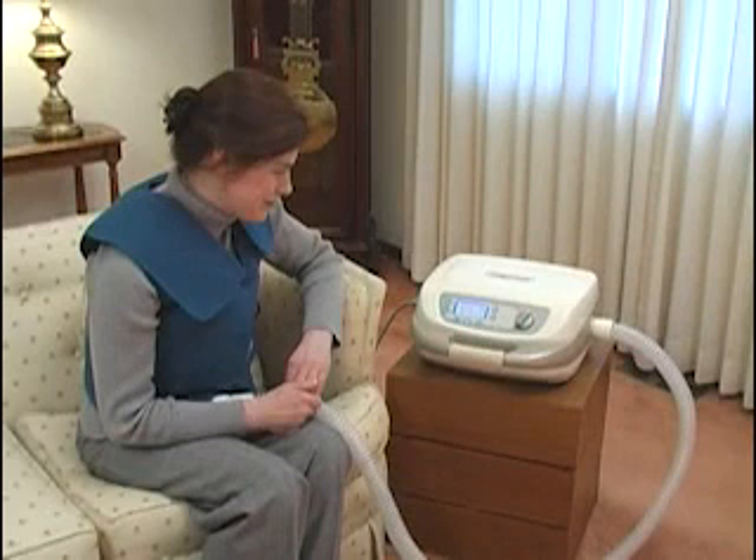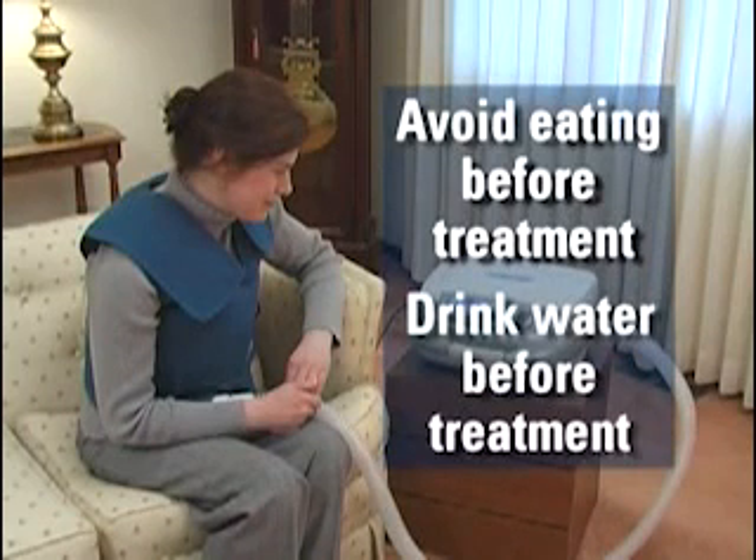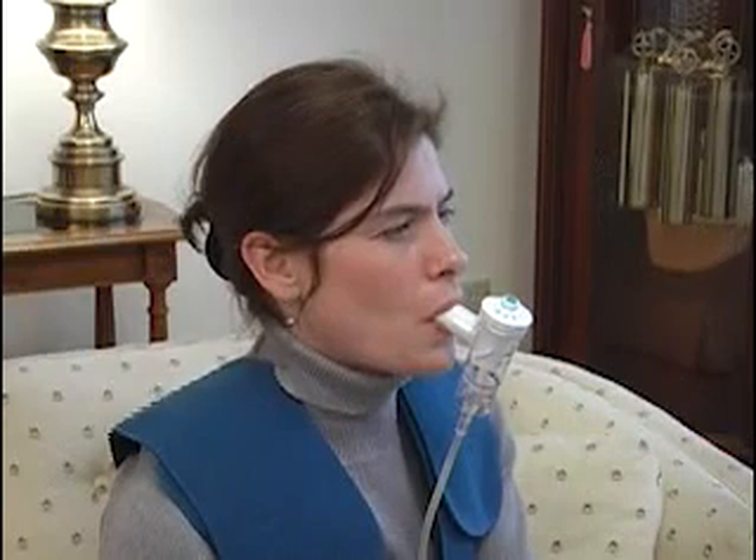To make your therapy session more comfortable and effective, consider doing your treatment before eating. Vest therapy is rarely comfortable after a large meal. Drink a glass of water before therapy to hydrate and thin secretions. Many physicians also prescribe the use of nebulized aerosols while performing vest therapy. Ask your physician for instructions.